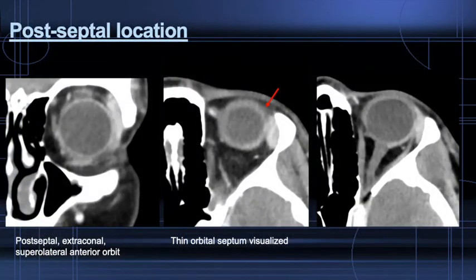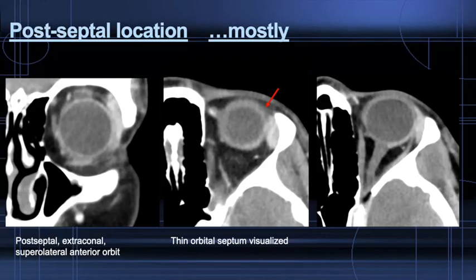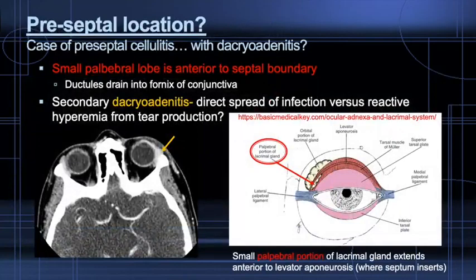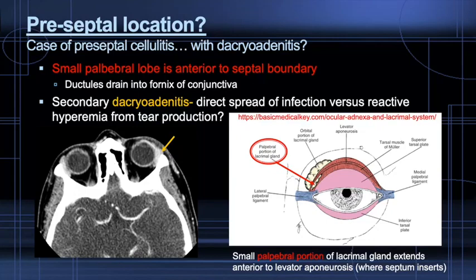Location of the lacrimal gland appears post-septal and extraconal. On the middle image, the gland appears posterior to a thin, visualized septum. But tears aren't secreted into the post-septal space, so finer inspection of anatomy is required. In fact, there's a small palpebral lobe of the gland that extends anterior to the levator aponeurosis and tarsal plate in the pre-septal space. So the lacrimal gland is both a pre-septal and post-septal structure, but mostly the latter.